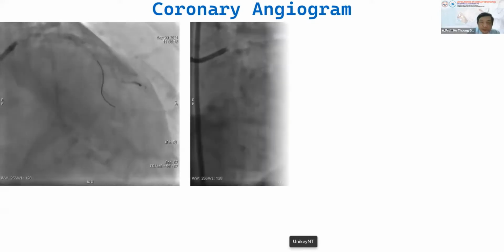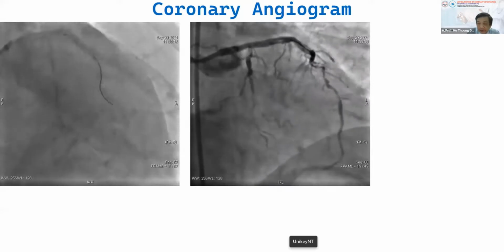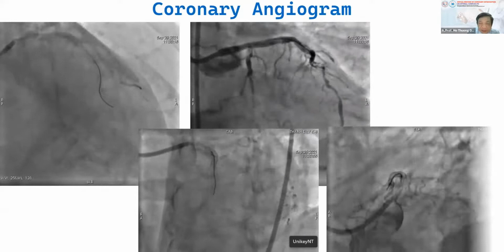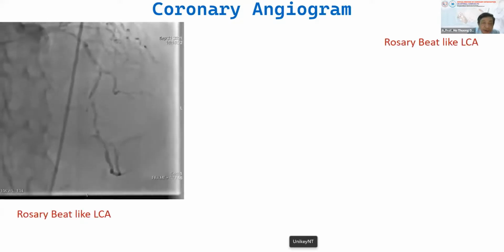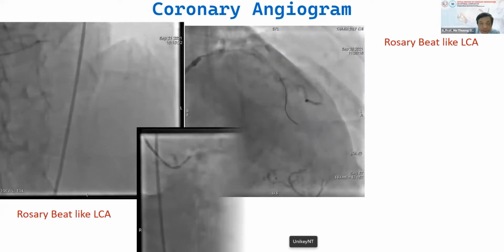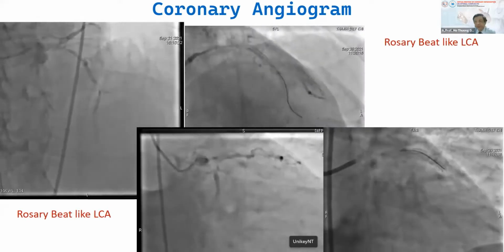So the last result, I think it's okay. I don't touch the circumflex. It's very complicated. So before PCI, after PCI, before PCI, after PCI, I think the result is good.